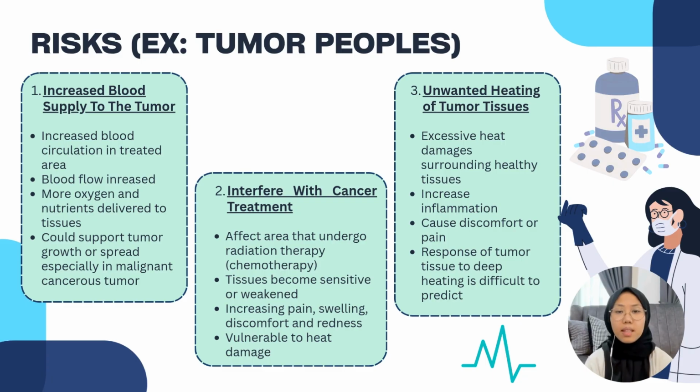Secondly, diathermy may interfere with cancer treatment. If the patient is undergoing radiation therapy or chemotherapy, the tissues are often sensitive and weakened. Applying deep heat can increase pain, swelling, redness, and discomfort, making the tissue more vulnerable to heat damage.